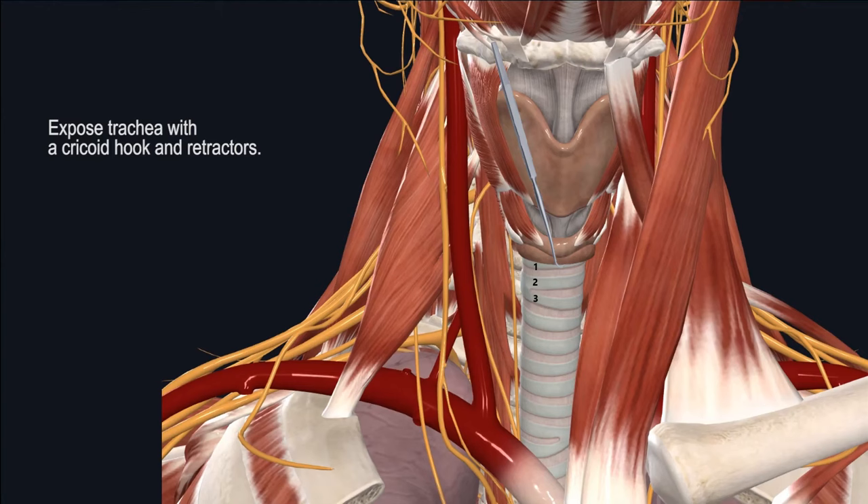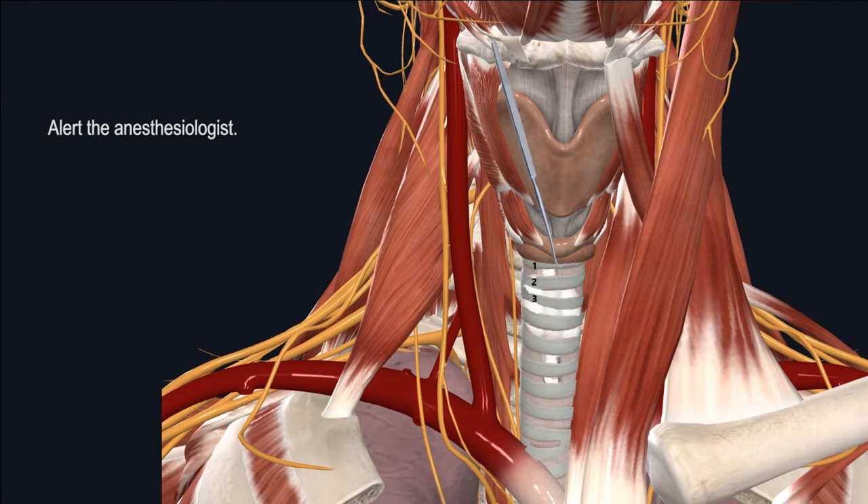Use a cricoid hook and appropriately sized retractors to gain adequate exposure to the trachea. Let the anesthesia team know that you're about to enter the airway. Here, you can see the endotracheal tube located within the tracheal lumen. Once you confirm adequate hemostasis and you're about to enter the airway, you can start by deflating the endotracheal tube cuff and advancing it distally towards the carina. This minimizes the risk of popping the endotracheal tube cuff while entering the airway.